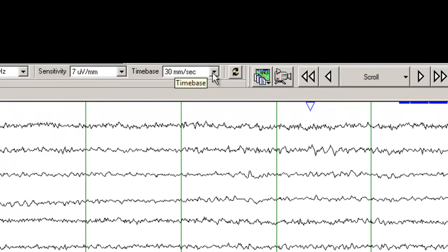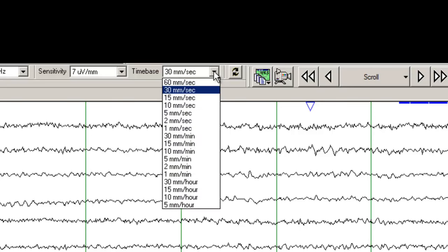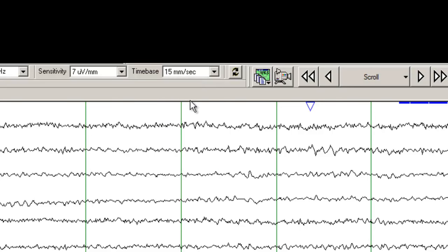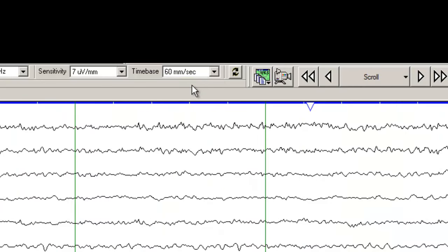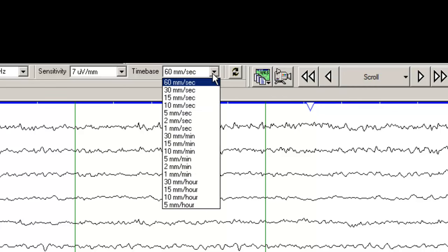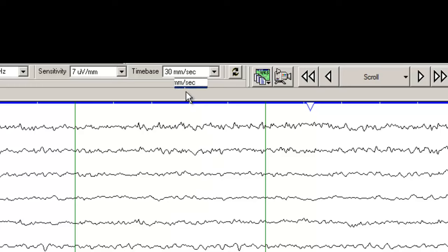The time base is the time elapsed between the two green lines. Right now it is set at 30 mm per second. If I make it 15 mm per second, the EEG appears all compressed. If I set it up at 60 mm per second, you are able to visualize in more detail the frequencies between each one second. The default we typically use is 30 mm per second, and that's what I'm going to set it back to.